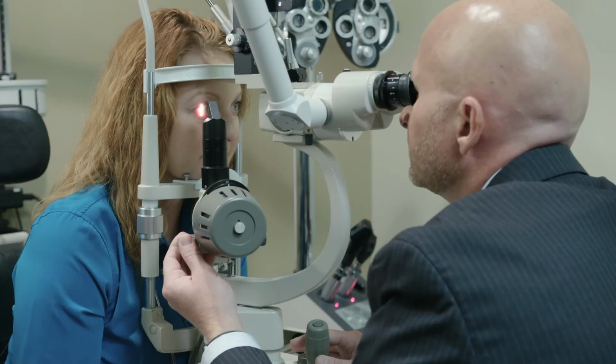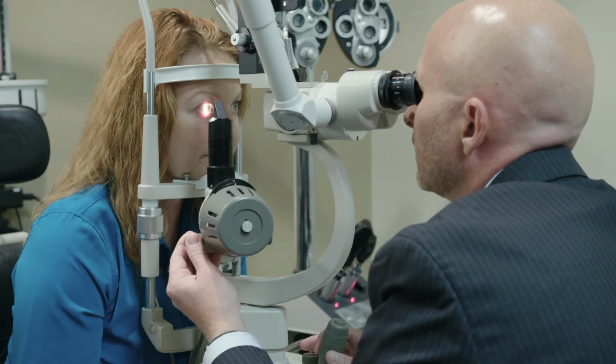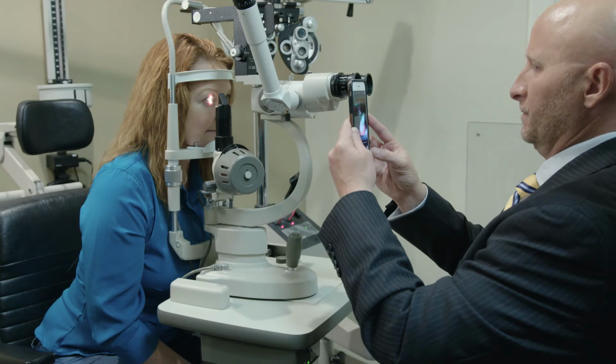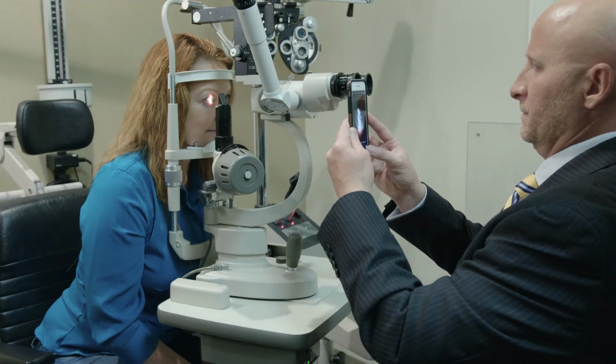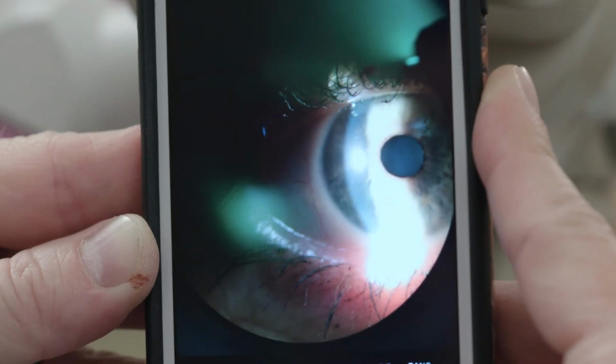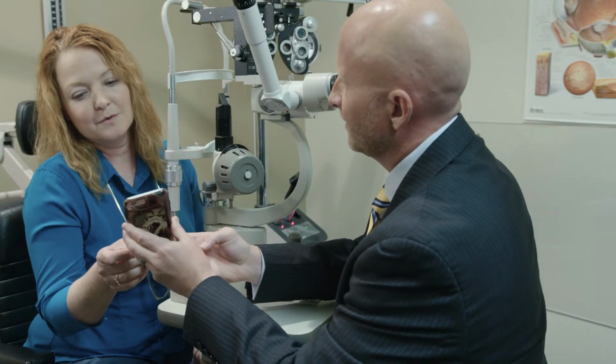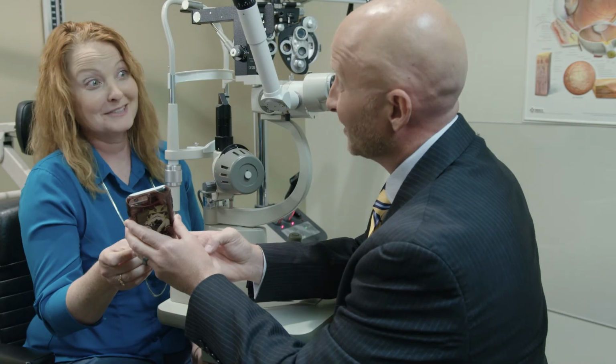Did you know that you can actually show your patients what you found from doing these dye tests? It's simple. Just take a picture of their corneal staining with their own smartphone. It helps them better understand their issues with their eyes when they can actually see the test results for themselves. This also helps highlight why they need to follow through with that treatment plan.